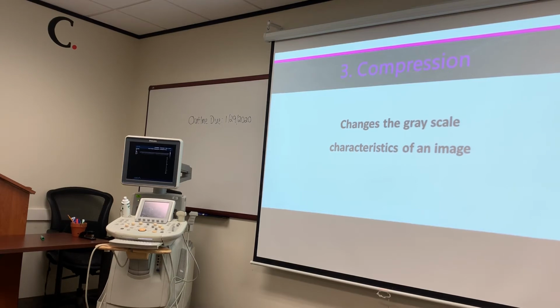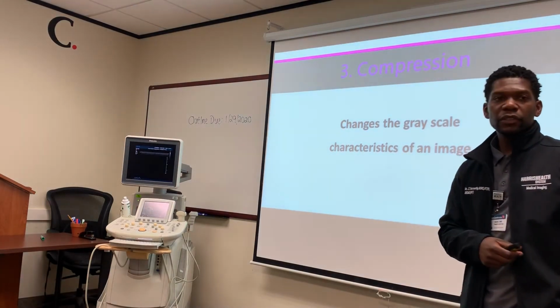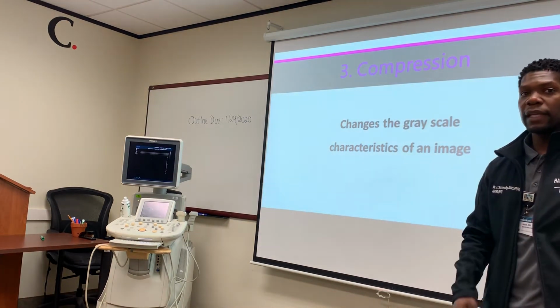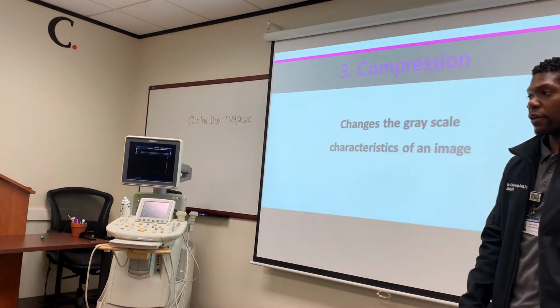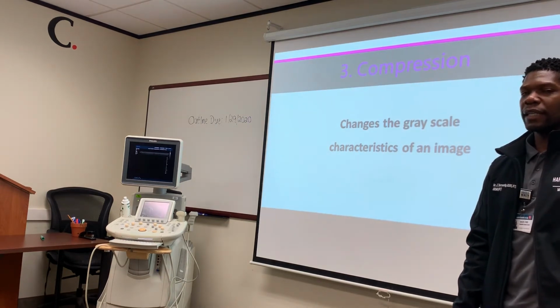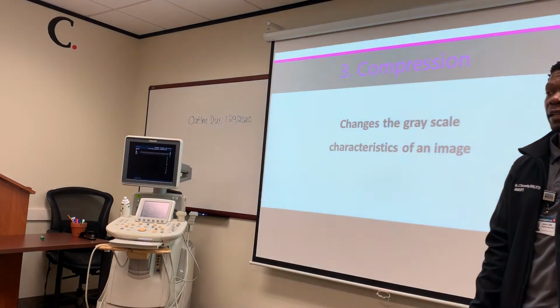It's the depth. Because it's traveling deeper, we know that that's the use of a lower frequency transducer than that 4 megahertz. It's probably a 2 megahertz transducer. So if I have numbers right there, and I have something less than a 4 megahertz transducer with that exact same question, you're going to pick the one that is lower than 4 megahertz, correct? Everybody understand that question? Because I had that question on my test last year, and people weren't getting it because I didn't go over it.